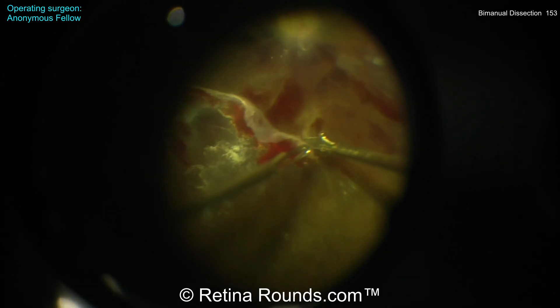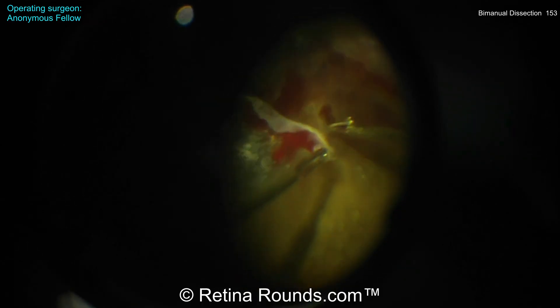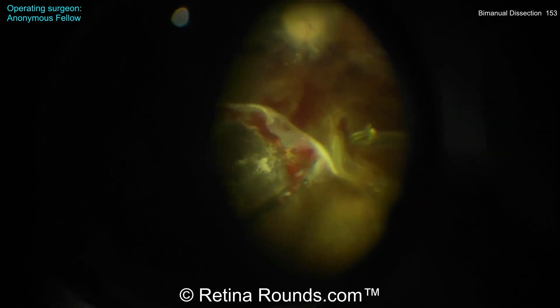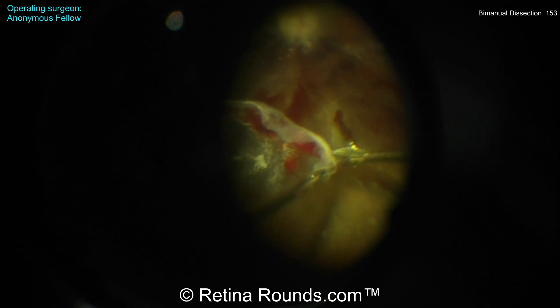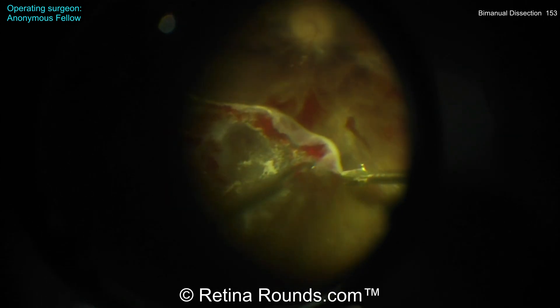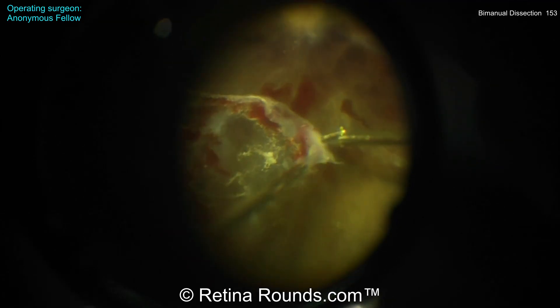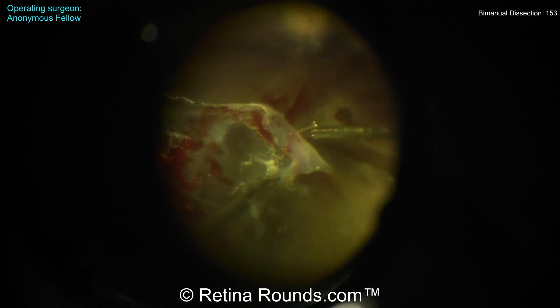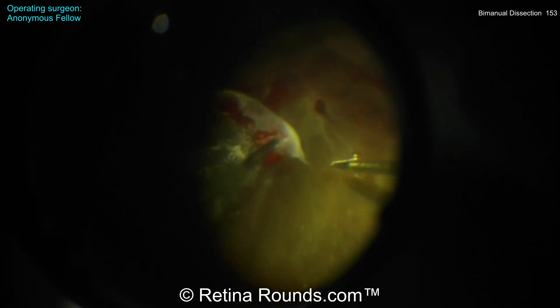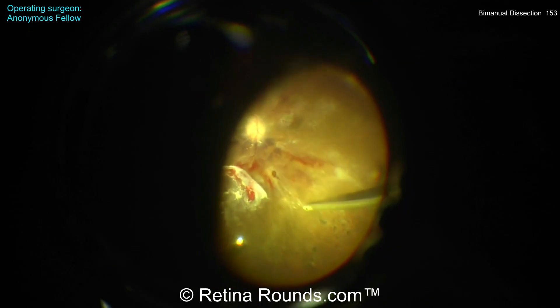This approach is much better. You see here the membrane being held and the scissors dissecting in more of a nasal-to-temporal approach. This is going to be far more efficient. You see the closed scissors there bluntly dissecting, and now using the open scissors to cut these fibrovascular membranes. I like this approach — I would like to see that membrane held with a little bit more traction, but this is a much, much better approach. The angle of going nasal-to-temporal is far safer.